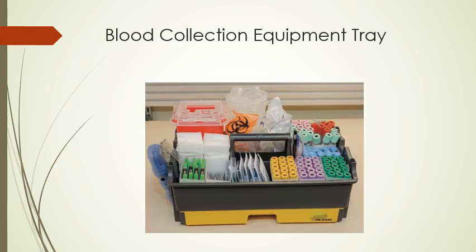Blood collection equipment tray. This is sort of what it looks like — a device we use to organize all of our equipment. In here there's collection tubes, needles, a sharps container, a biohazard bag, gauze pads, tape, and alcohol or antiseptic cleaning solution. All these things are there so we have everything we need and we're ready to go when we walk in to do the blood draw.